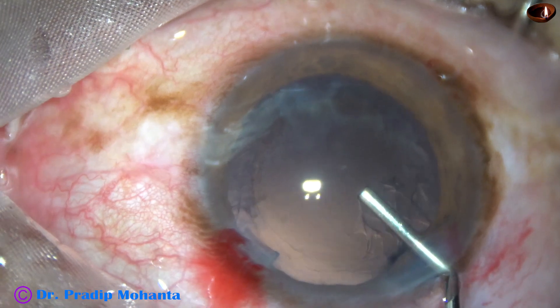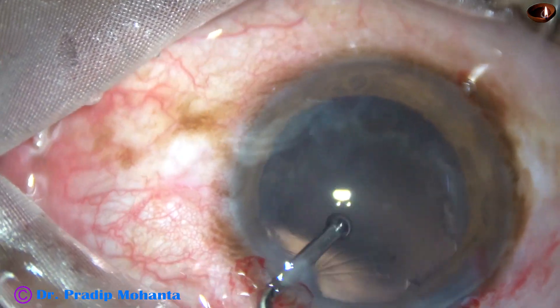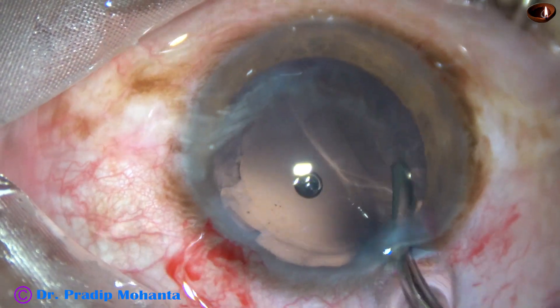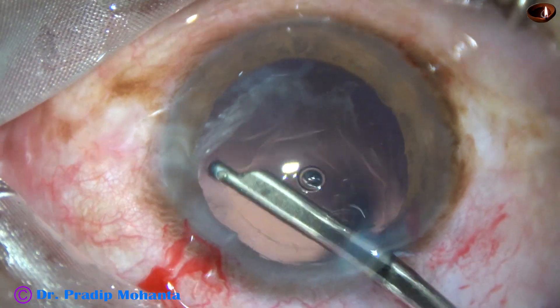The phaco handpiece is withdrawn. We have taken 1 minute and 17 seconds for management of this nucleus. So phaco is fun and phaco is fast for routine cases.